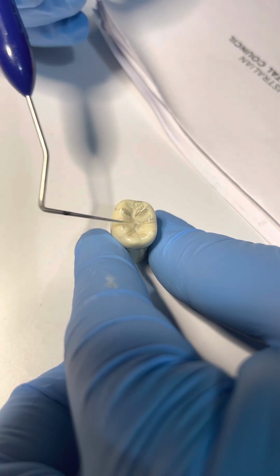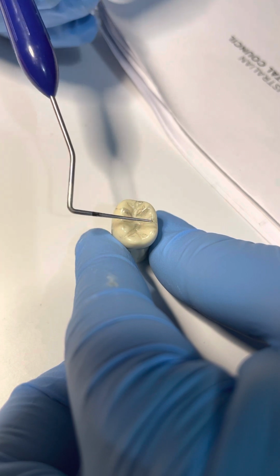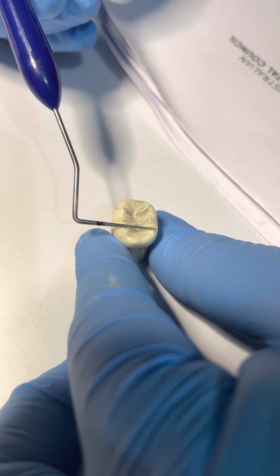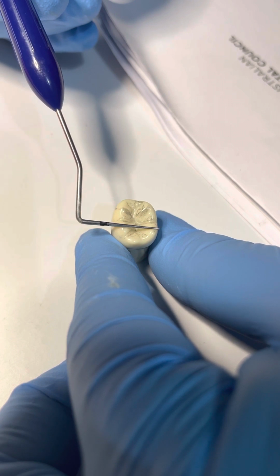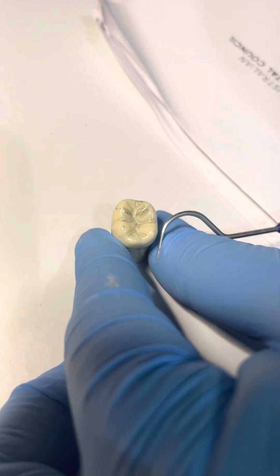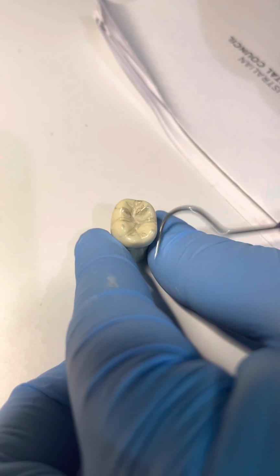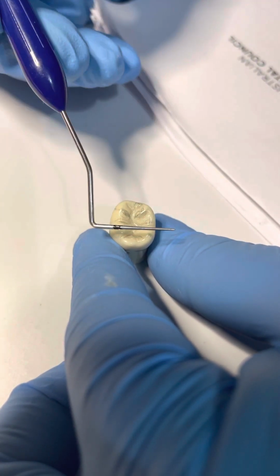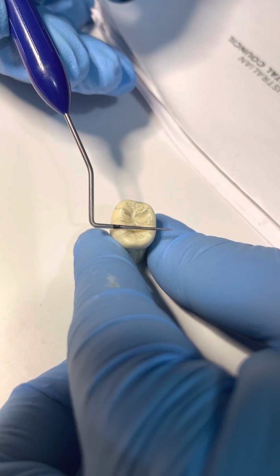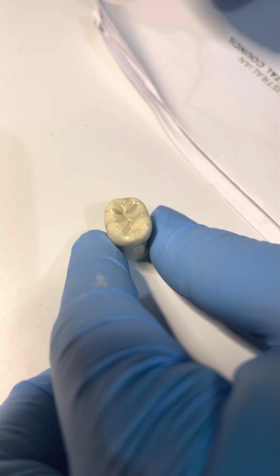But in the distal, it's not parallel. If you look at the cusp tips of the distobuccal and the distolingual, the distolingual cusp tip is about 0.5 millimeter away. So this is our distobuccal cusp tip, and this is our distolingual cusp tip, right? It's not parallel. See? Mesial is always parallel.